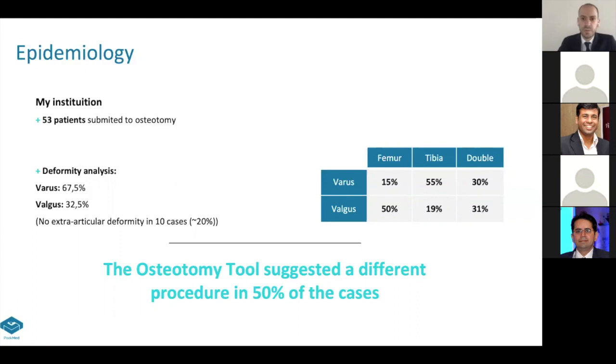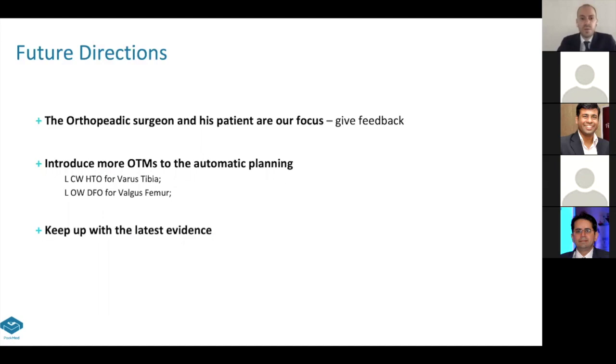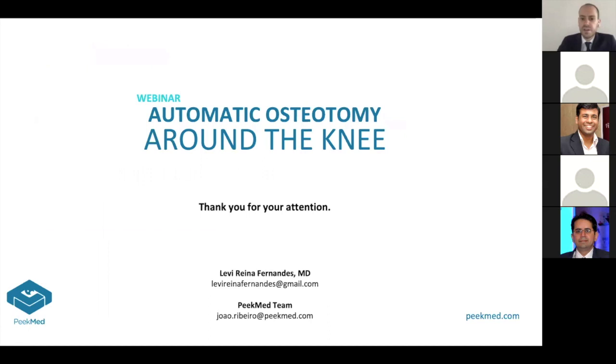So for future directions for me and PeekMed, we welcome every feedback we can get from everyone that is using the program. We will try to introduce more osteotomies to the automatic planning because we have some surgeons that still prefer to do lateral closed wedge HTO for varus on the tibia and lateral open wedge DFO for valgus on the femur. And we will continue looking at the latest evidence to keep this tool the most advanced possible.